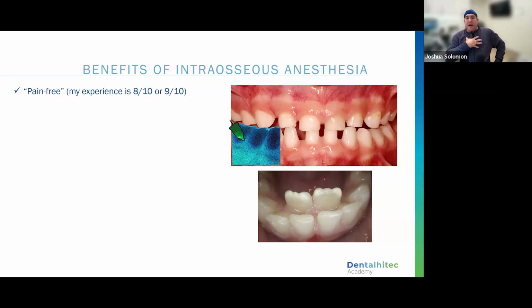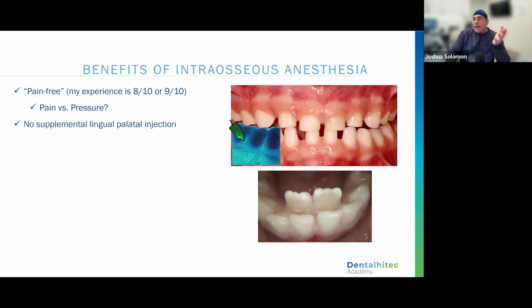9 out of 10 times, I know I can sit down and I can numb, for example, here on R, S, and T, and I know I can give that stage 1, that stage 2, and I can deliver a half carp or quarter carp without the patient feeling a thing at all. So I think it's not only the pain, but it's also just no sensation. And that does nothing besides make that restorative appointment much more simple for you, right?